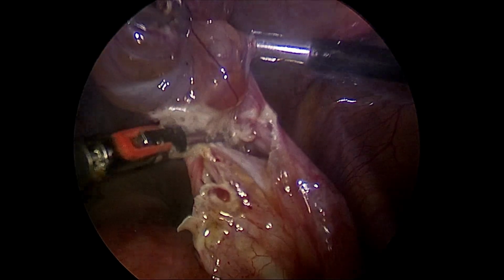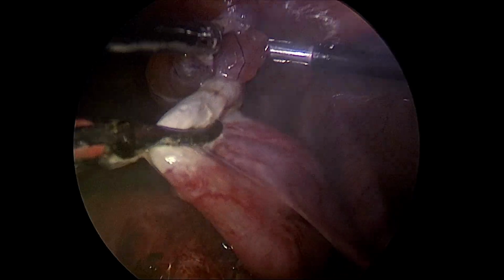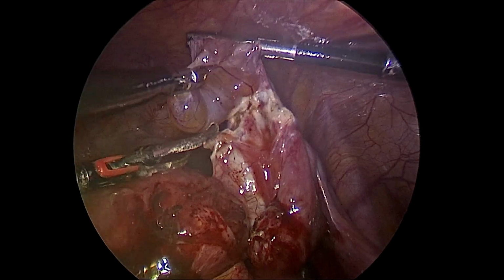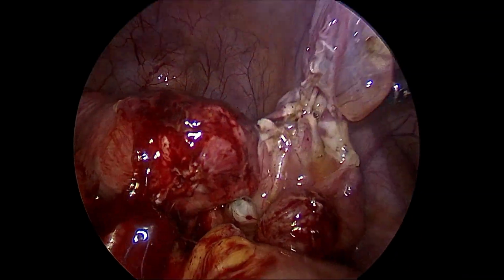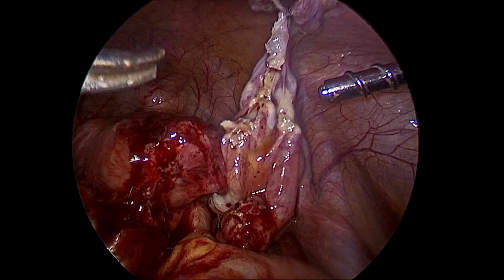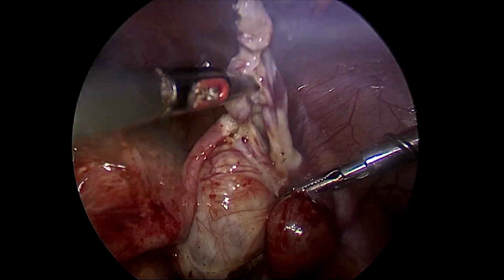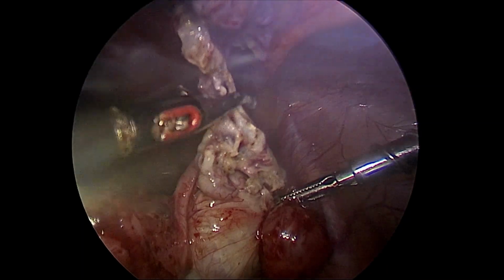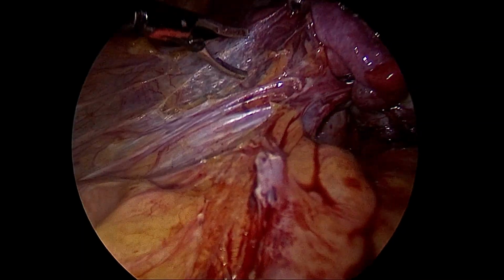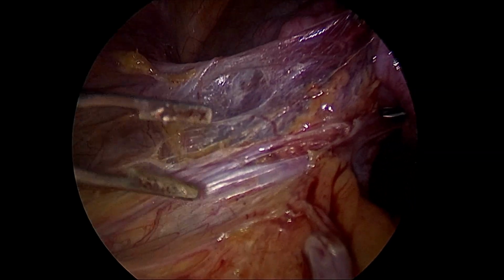Just care needs to be taken that these cysts can be adherent to the tube and the ovary, as you can see in this particular scenario, and the tube needs to be dissected out separately while dissecting these peritoneal inclusion cysts. These are almost completely avascular spaces, so with just a bipolar shearer we are able to do that.